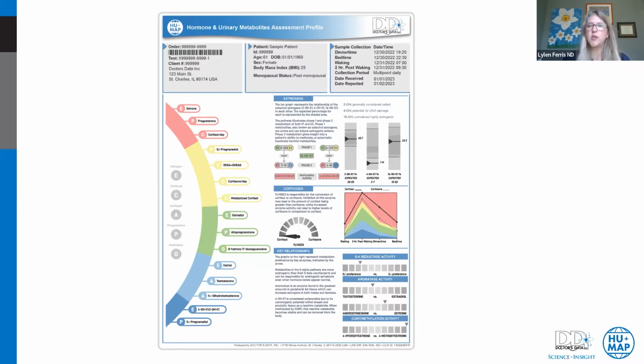So this summary page highlights all of the most clinically actionable information in this report. We determined this based on which analytes are the most well-researched, as well as speaking to providers who frequently utilize this test and taking into account the information that they utilize most. We know that providers have very little time. Our aim was to give you as much information at a glance as possible in the first 2 pages of the report. So we'll get into the second page in a little while, but I wanted to walk you through this first page, or this summary page, section by section.